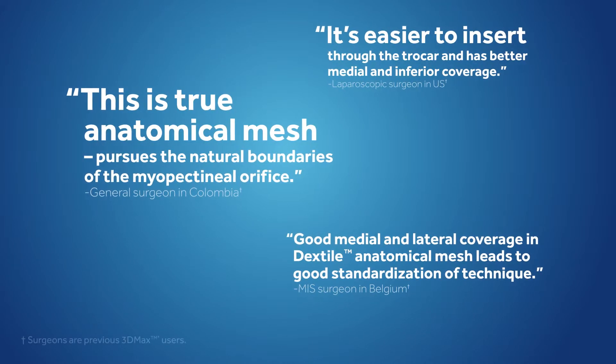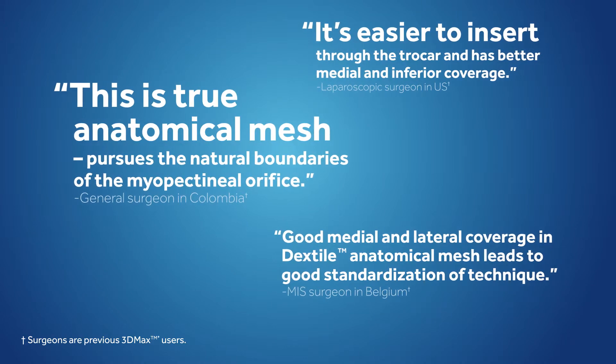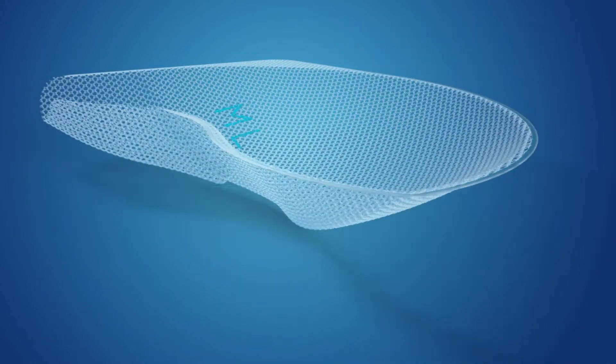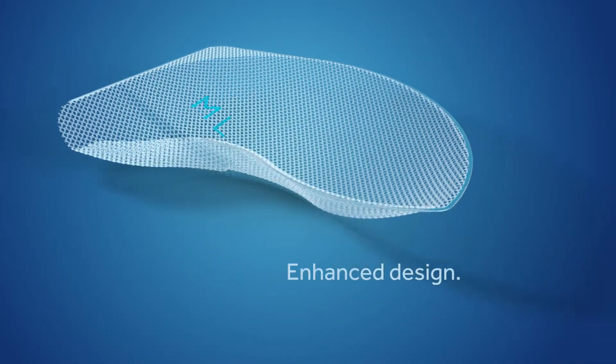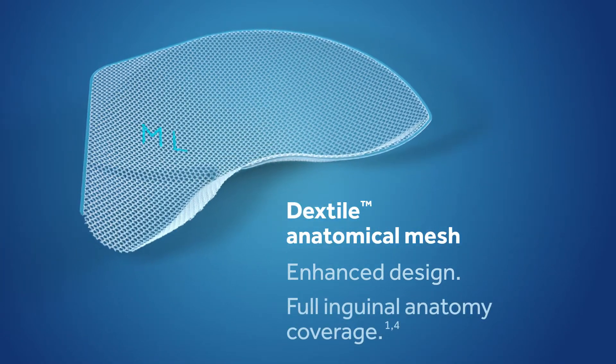Surgeons everywhere are discovering the difference. Enhanced design, full inguinal anatomy coverage — Dextile Anatomical Mesh.